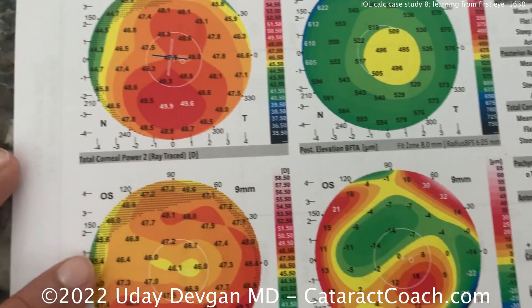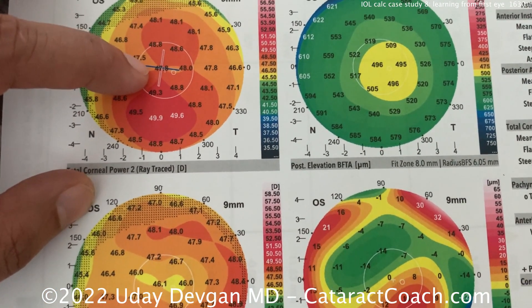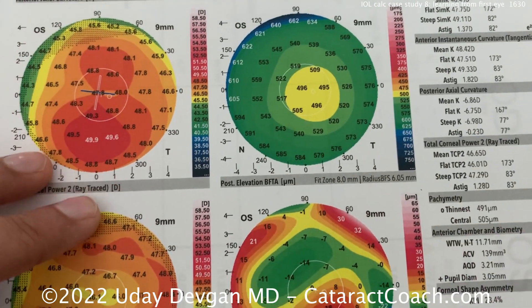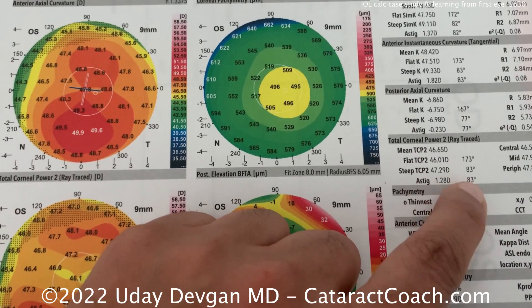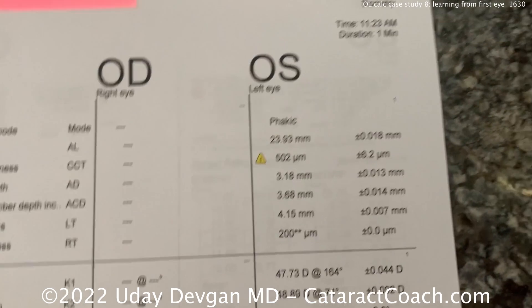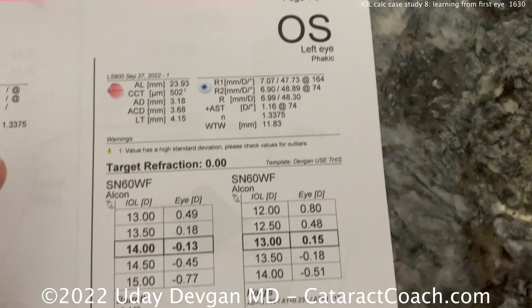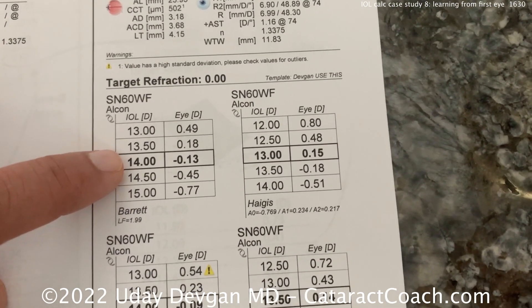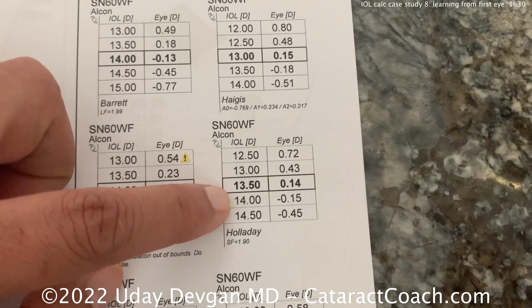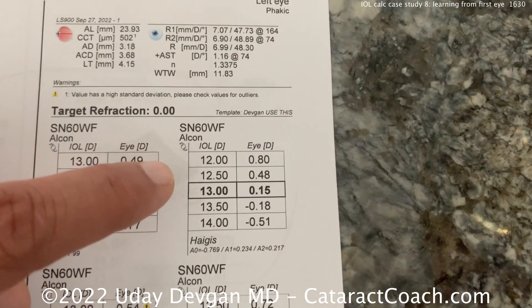Here's the left eye, the one we're going to do surgery on. Still a little asymmetry here in the central cornea, and it's pretty steep — look at that one spot down here, 49.9. This is giving 1.28 diopters of astigmatism at 83 degrees. Looking at the repeat biometry and calculations for his left eye, Barrett says maybe a 14, Hill 14, Holladay 13.5 to 14. We're going to avoid the SRKT.